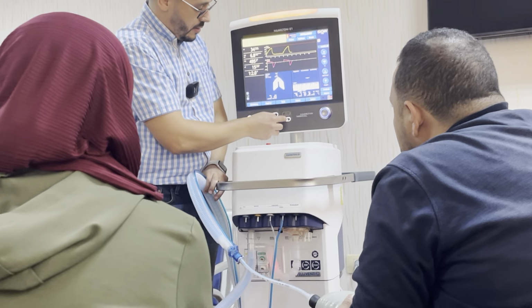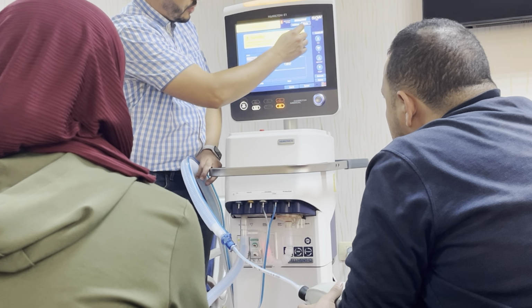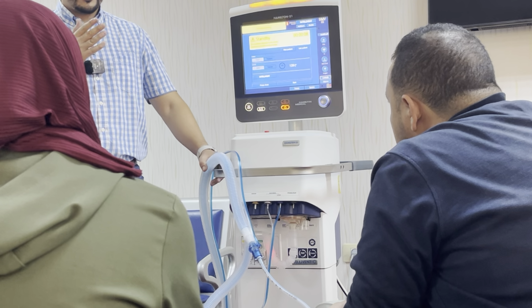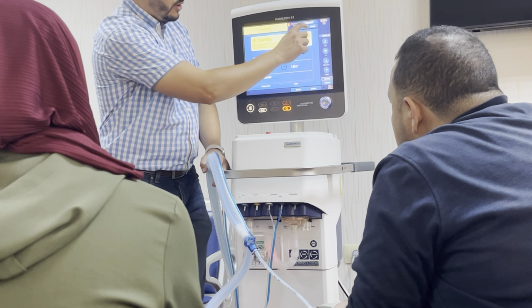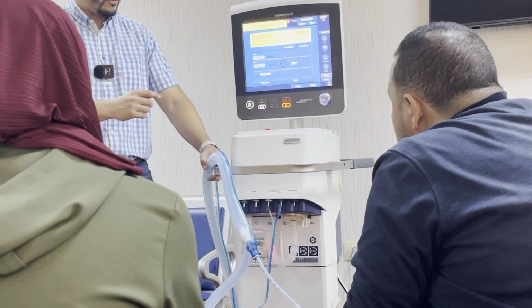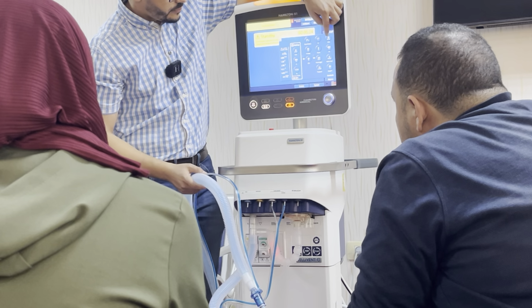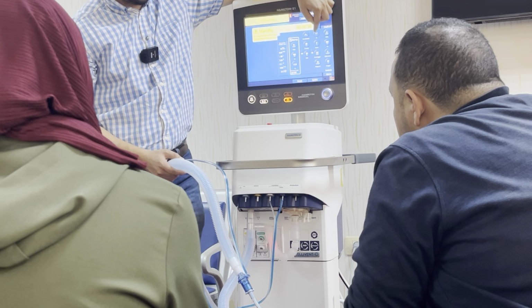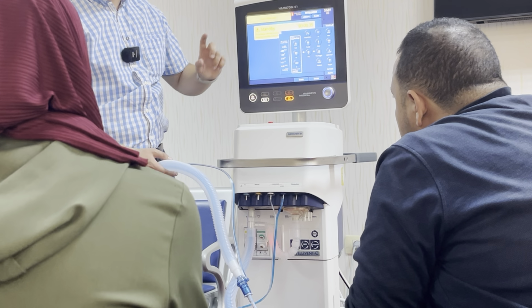Okay, let's go to the SIMV now, because you asked the question. Okay? We have two synchronized modes, two intermittent synchronized modes: volume control, pressure control. As I said before, the only difference is with this parameter, either tidal volume or P control. Okay? This one is volume control. What we have inside the volume control, we have the rate, tidal volume, PEEP, inspiration time, and the trigger. We have one new parameter, which is pressure support.